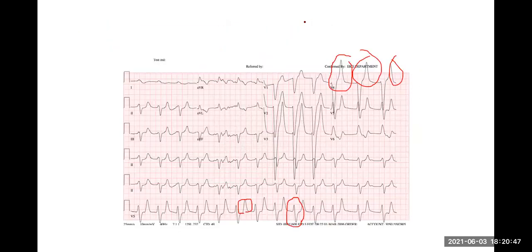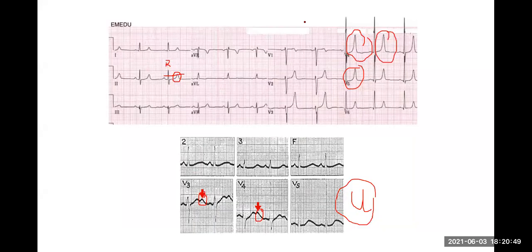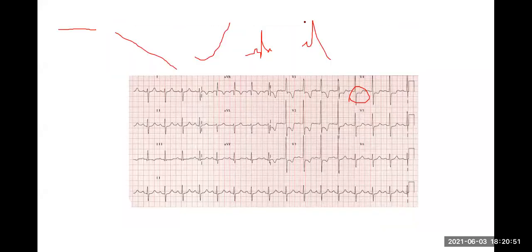Remember, to detect right ventricular infarction you need a special lead and that is called V4R. Without that it is very difficult to diagnose.